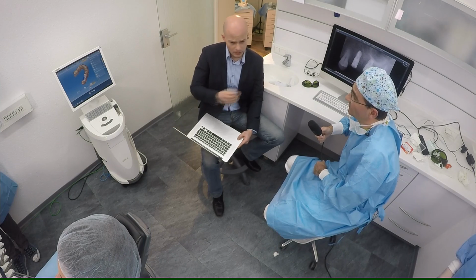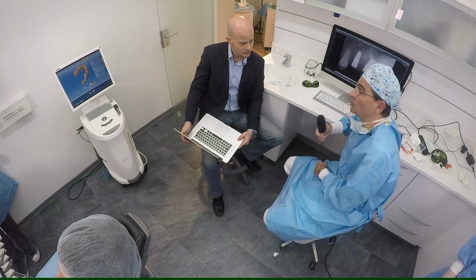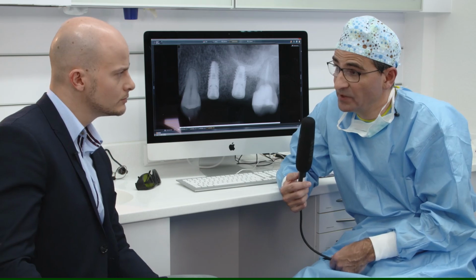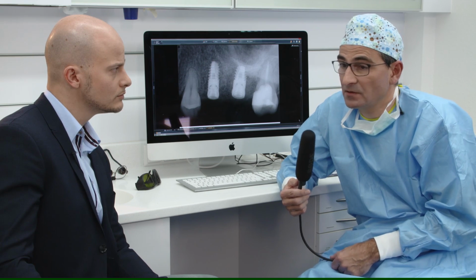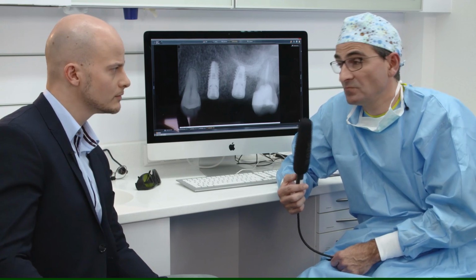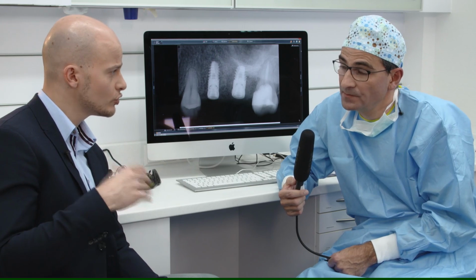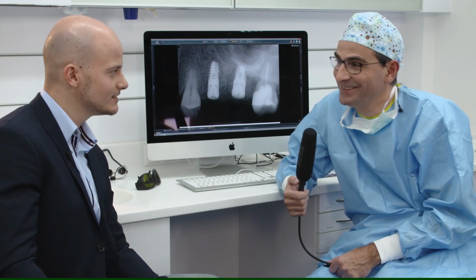I just got another question. Why did you open the tissue? Why did I open the tissue? Because we saw in the cone beam that there is maybe a bone edge, and I want to reduce this bone edge if it is there. And the other part is, if we work with healing abutments or something like this, I could handle my gingiva better. That's the point. And also, you avoided relieving incisions, right? Yes, to keep the blood supply, obviously. That's what we learned in all the beautiful lectures that we see all over the world.